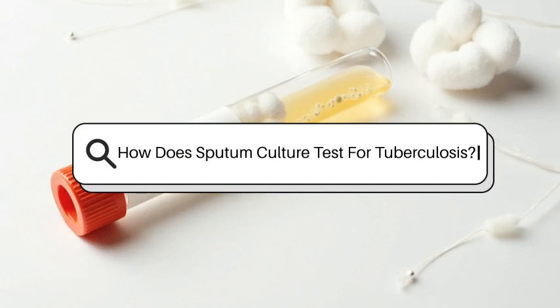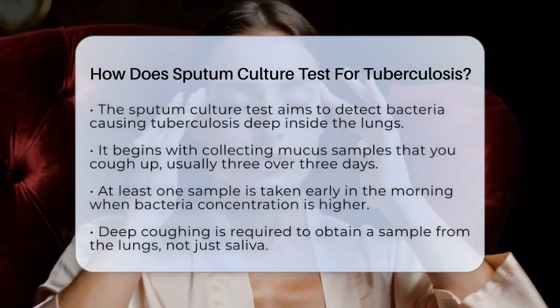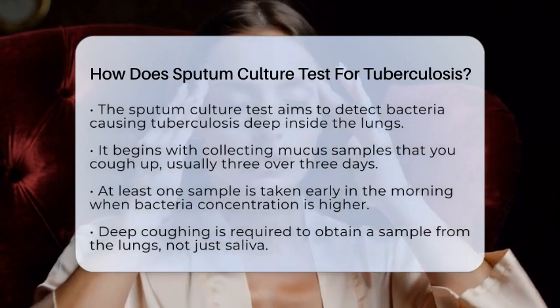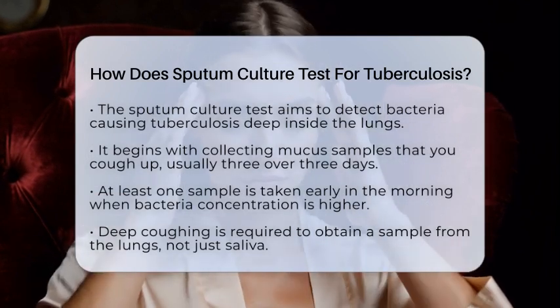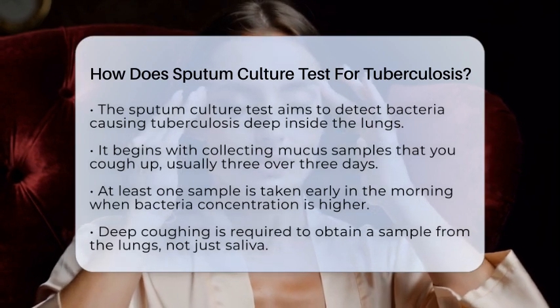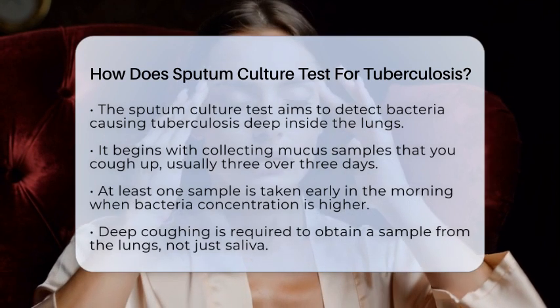How does sputum culture test for tuberculosis? Imagine trying to catch a tiny, slow-growing bacteria that hides deep inside your lungs. That's what a sputum culture test aims to do when diagnosing tuberculosis. The process starts with collecting samples of mucus that you cough up from deep inside your lungs.